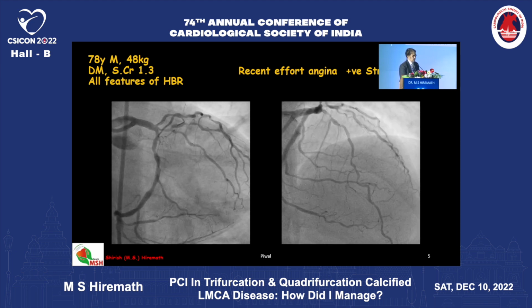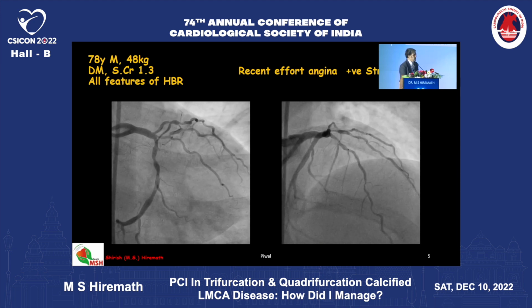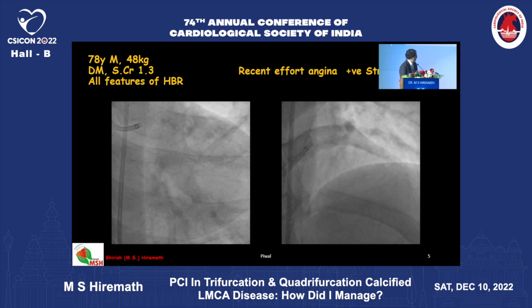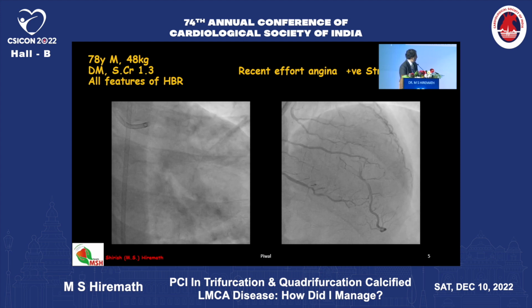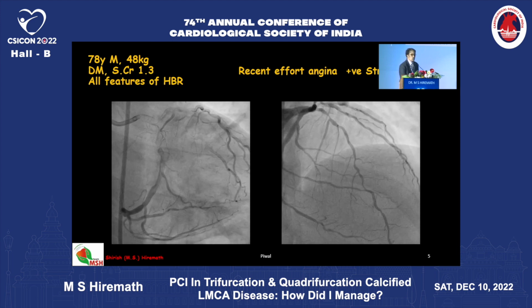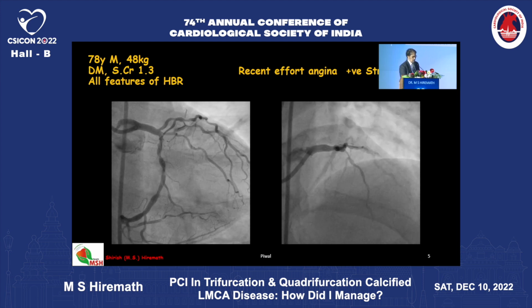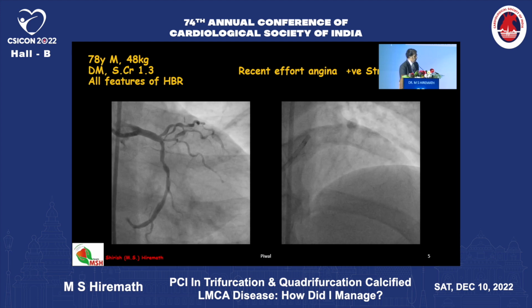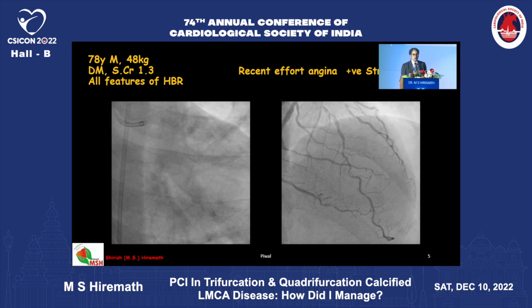This is a case, 78-year-old, and he had a high bleeding risk. This was one of our concerns. And you have LAD, which is showing a disease, the OM1, which actually has two branches, also showing an ostial disease. And then you have a circumflex, which is a dominant circulation, you can see here. So in this case, whether circumflex needs a stent, this is an important issue.